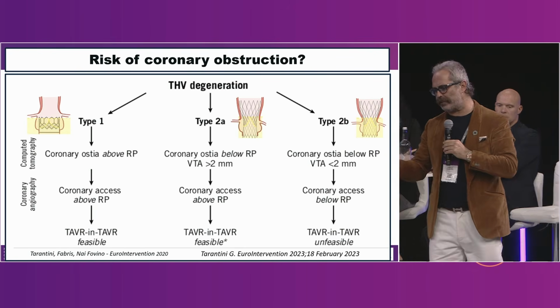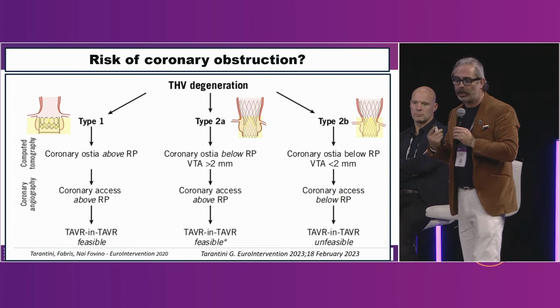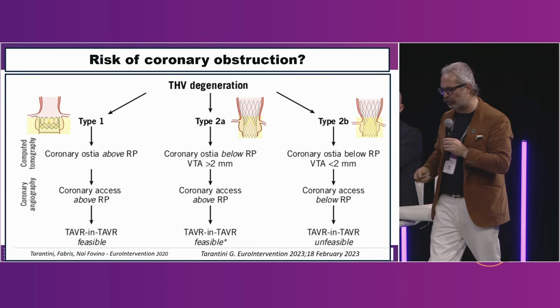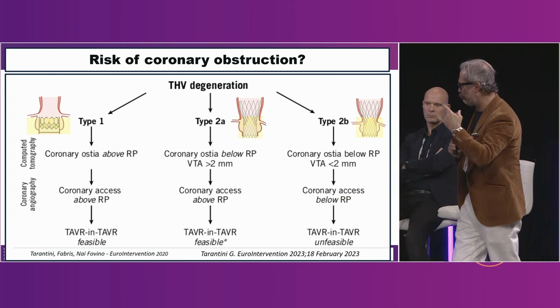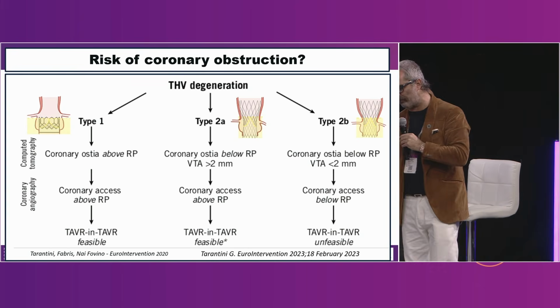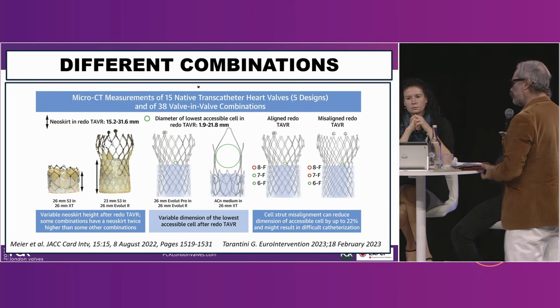The last point is that when the TAV-in-TAV is not feasible, because there is a concrete, unacceptable risk of coronary occlusion, when you have a very narrow ascending aorta and you see clearly by angiography, by CT scan, that you don't have extra room, and when you go with the second valve, you create the sinus sequestration. Then we have different combinations to consider.